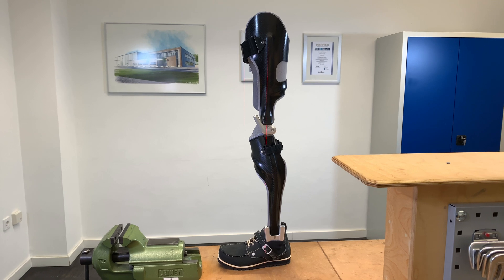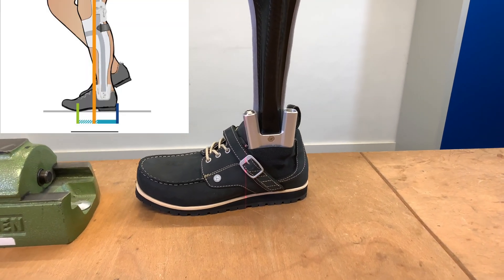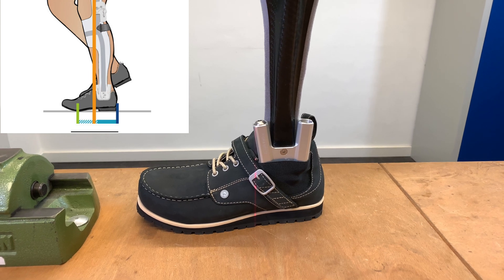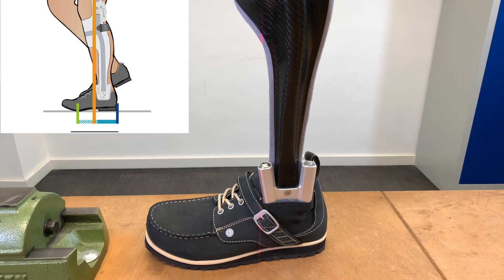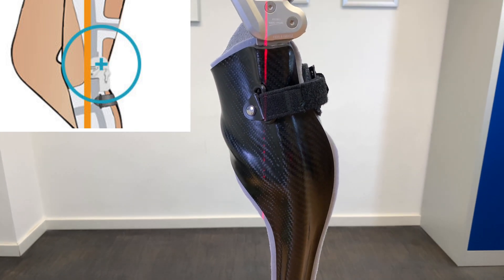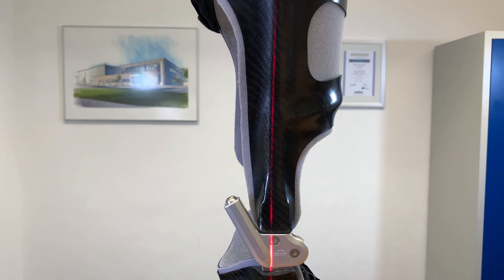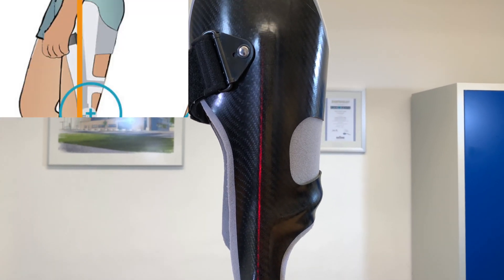Kontrolle des Aufbaus auf der Werkbank: Zu diesem Zweck stellen wir die Orthese in einen dazu passenden Schuh und prüfen, ob das Lot durch das hintere Drittel der vorderen Hälfte der Unterstützungsfläche fällt. Weiter sollte das Lot durch die Mitte des AP-Maßes fallen und durch die Mitte des Oberschenkels.